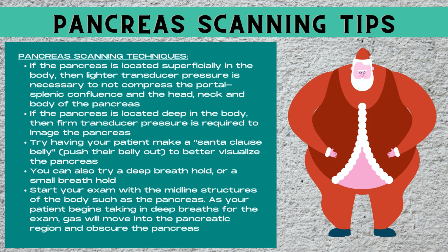Now let's talk about some scanning techniques that can be used to improve visualization of the pancreas. When the pancreas is located more superficially in the body, then it's crucial to use lighter transducer pressure so that you don't compress the Portal-Splenic Confluence and splenic vein, and also do not compress the head, neck, and body of the pancreas.